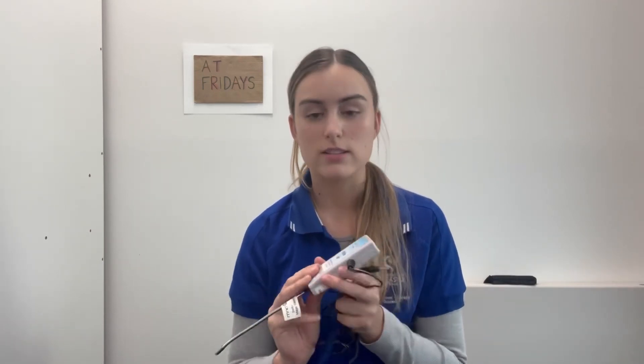Happy AT Friday. My name is Hannah. I'm an occupational therapy student who has been lucky enough to be placed at Action OT for my second year placement. Today I'll be talking about the Magic Wand Switch. It's a portable adaptive switch that allows somebody to operate a piece of technology or an electronic device using minimal movements.